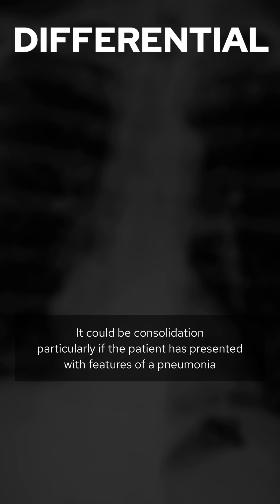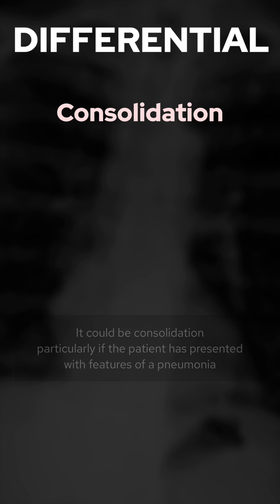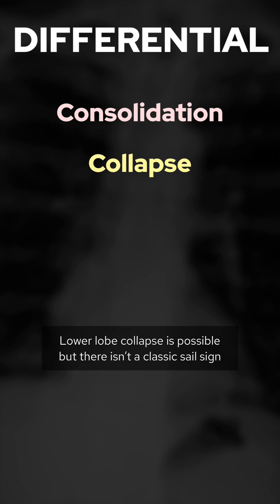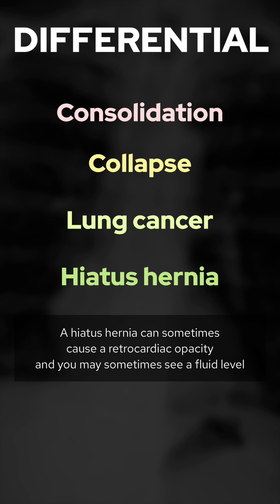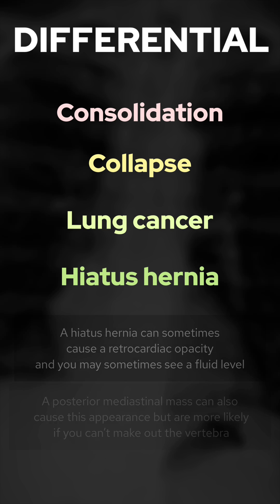It could be consolidation, particularly if the patient presented with features of a pneumonia. Lower lobe collapse is possible, but there isn't a classic sail sign. If the patient is a smoker, then lung cancer is a possibility. A hiatus hernia can sometimes cause a retrocardiac opacity, and you may sometimes see a fluid level.